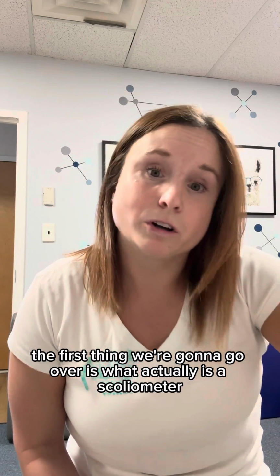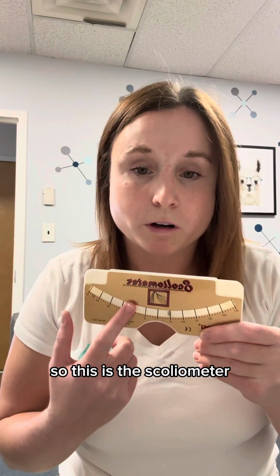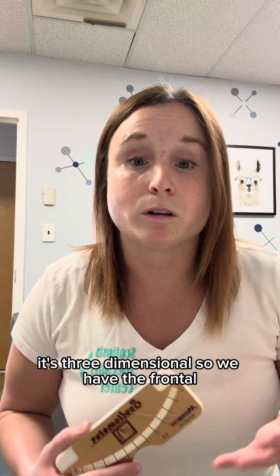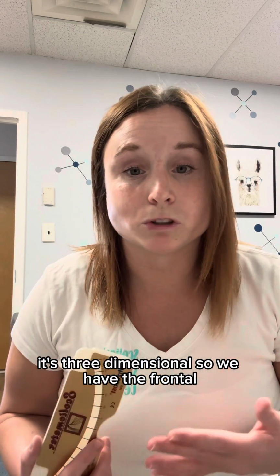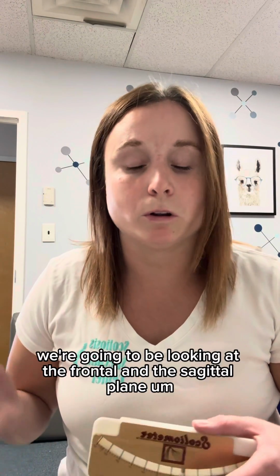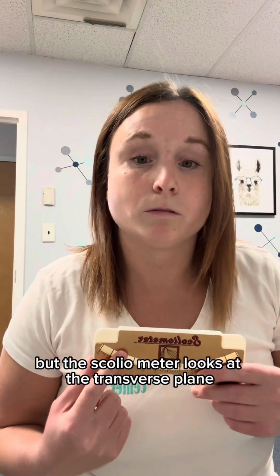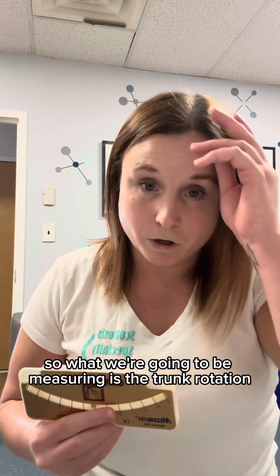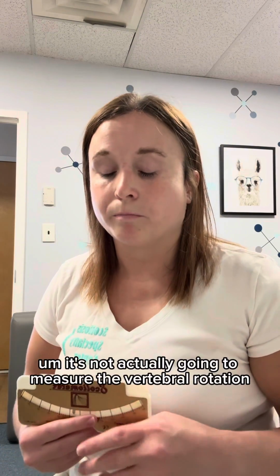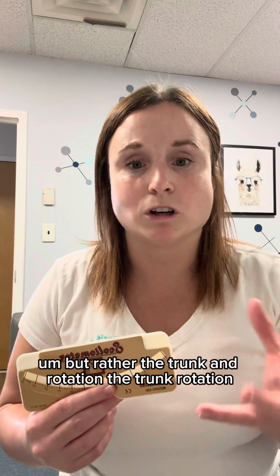So the first thing we're going to go over is what actually is a scoliometer. So this is the scoliometer. As you know, there are three components to scoliosis; it's three-dimensional. So we have the frontal, transverse, and sagittal plane. In the handout I just mentioned, we're going to be looking at the frontal and the sagittal plane, but the scoliometer looks at the transverse plane. So what we're going to be measuring is the trunk rotation. It's not actually going to measure the vertebral rotation, but rather the trunk rotation.